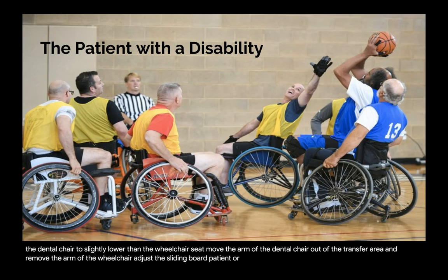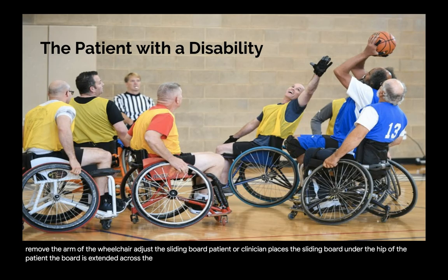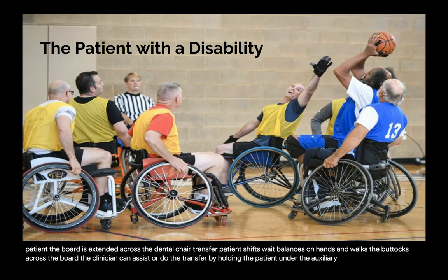Patient or clinician places the sliding board under the hip of the patient. The board is extended across the dental chair. Transfer: patient shifts weight, balances on hands, and walks the buttocks across the board. The clinician can assist or do the transfer by holding the patient under the axilla, or the armpits.